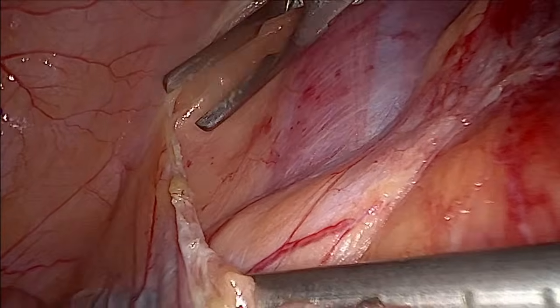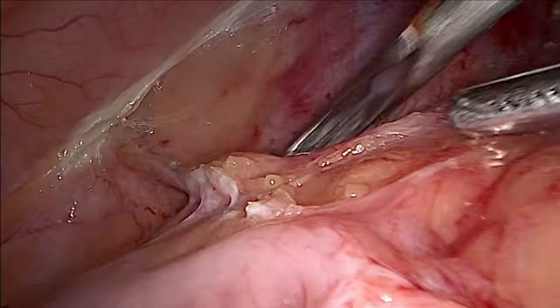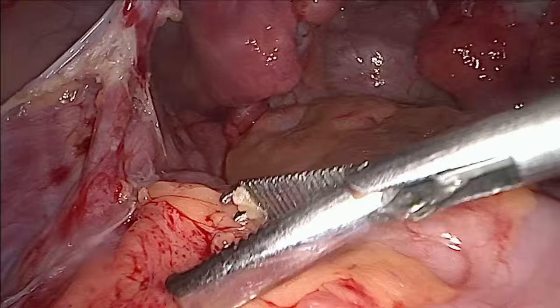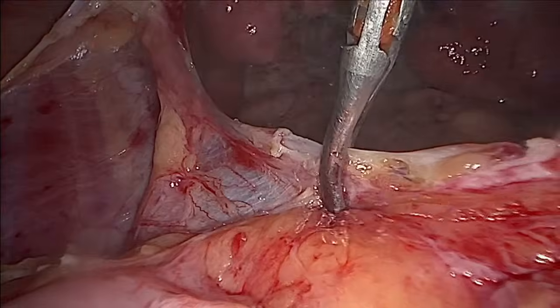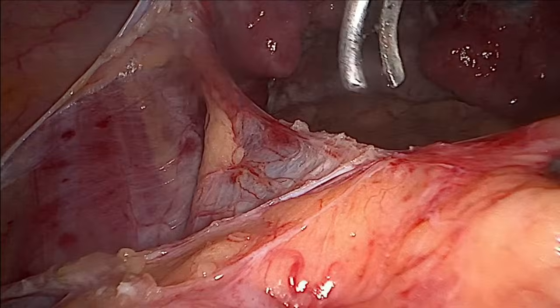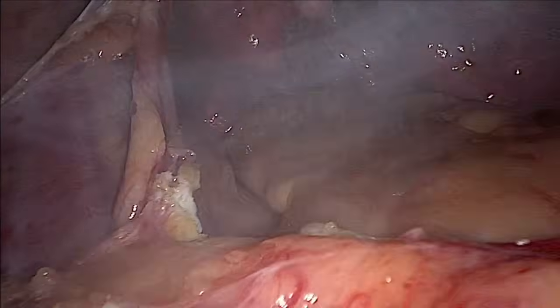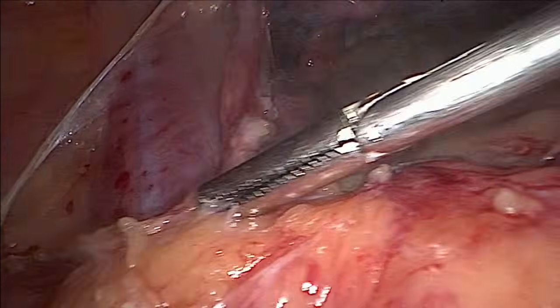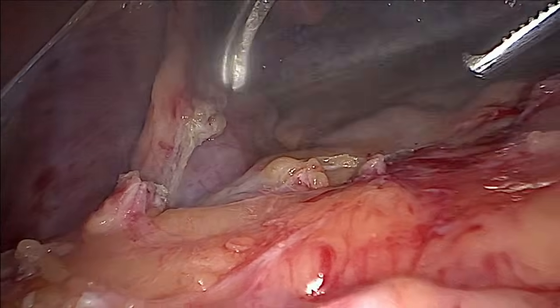Yes, you go, you create this space through blunt and sharp dissection both. Go this side. Yes, this much is enough for this. Again come back. So now this adhesion is completely gone here. I think you can clean the camera a bit.